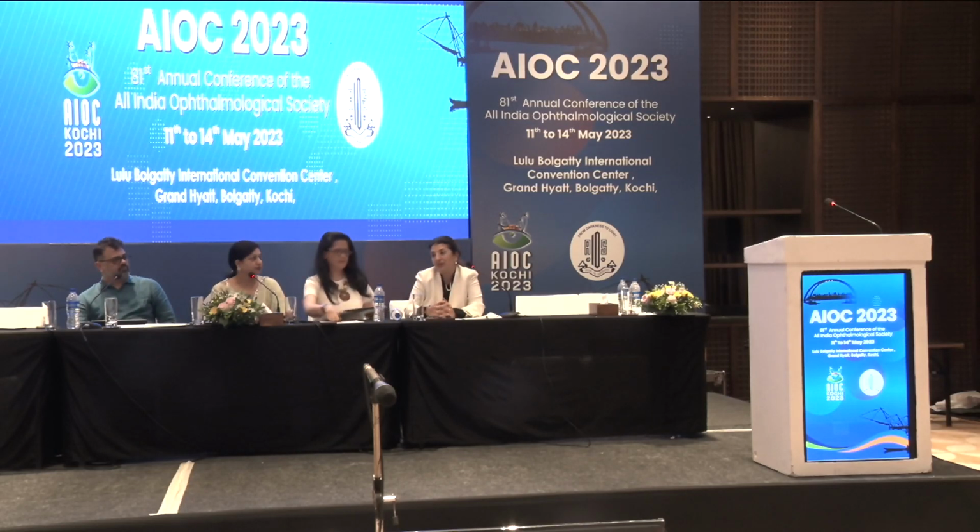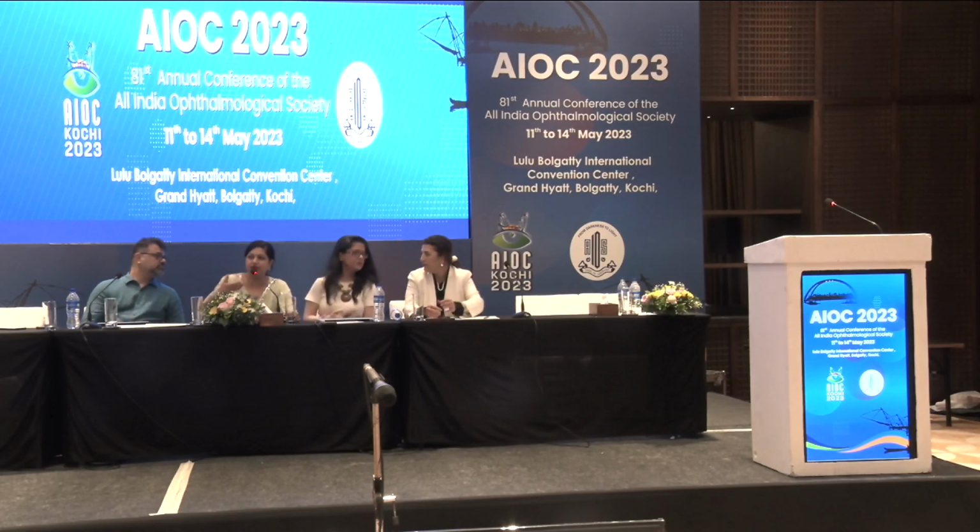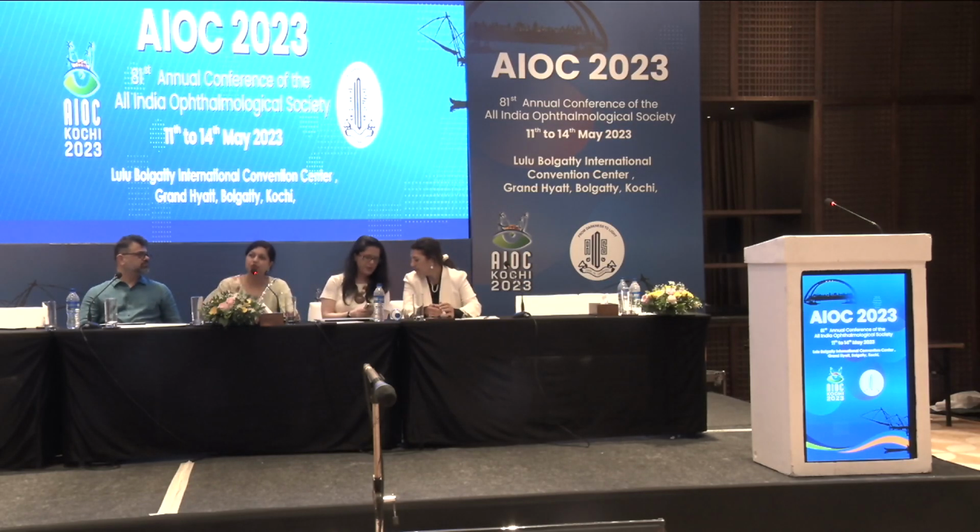But if the patient has had a previous refractive surgery, or if you're choosing a patient with an RK, which normally you would not put such lenses in, those are the rarer cases where you would have a refractive surprise. So if it's your own patient and you have picked it up early, say in the first week or the first 2 weeks, and you found out that it's a refractive surprise, if it's up to 1.5, you can probably wait and then do a laser touch-up.